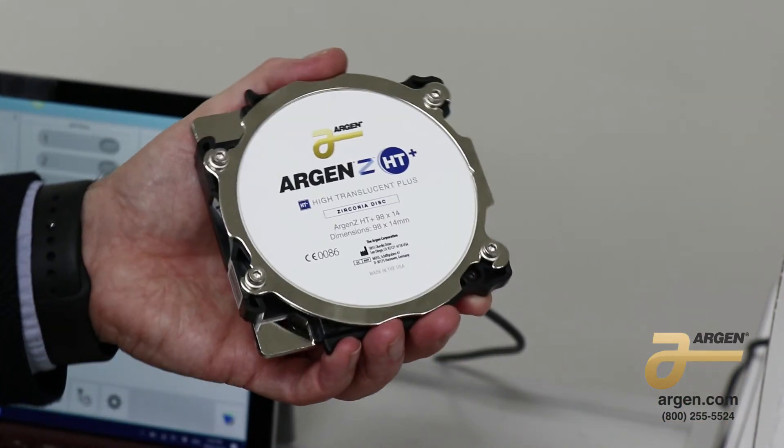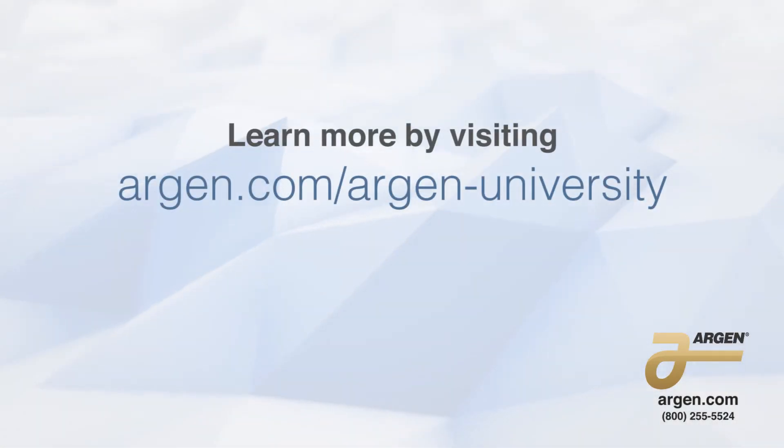This disc is now ready to insert into the mill. Here we go.